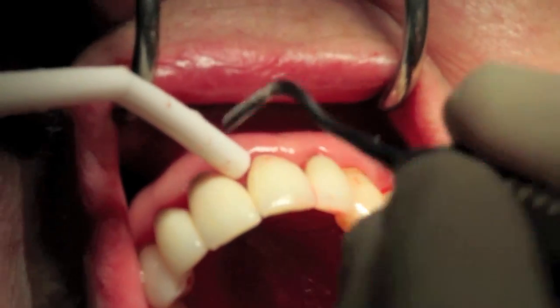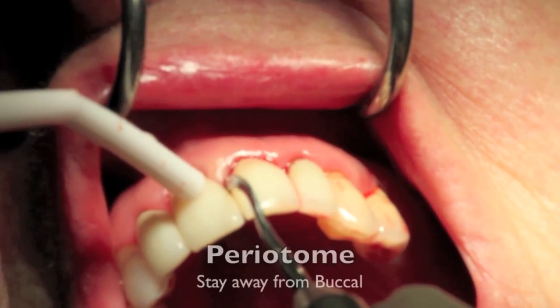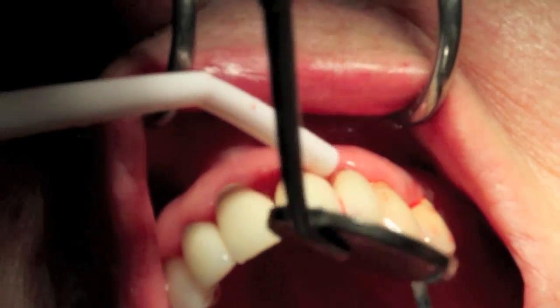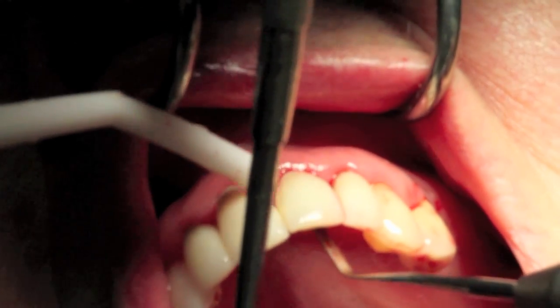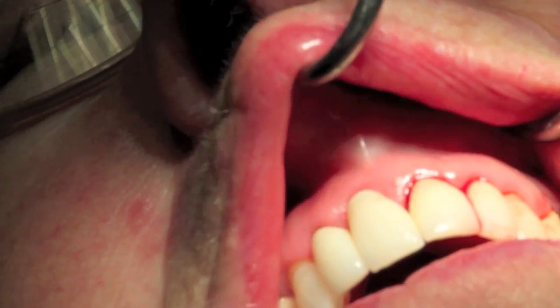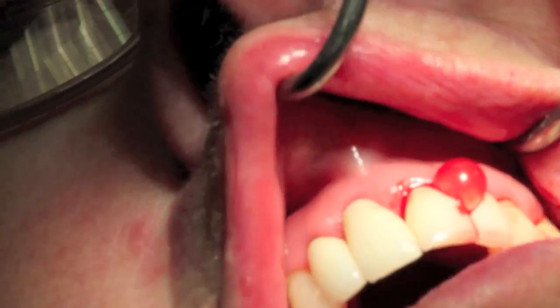You want to stay away from the buccal bone. It's okay to kind of separate the tissue, but stay away from the buccal bone with the periotome and get this down into the periodontal ligament space so you're able to get this root moving to get this out without any issues.